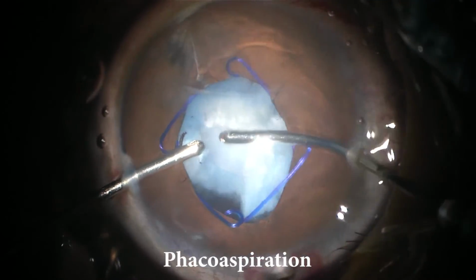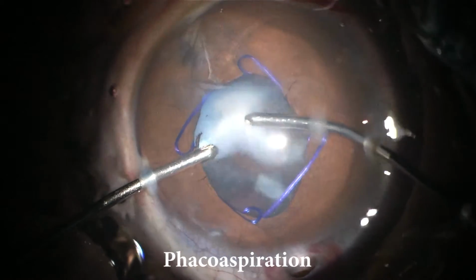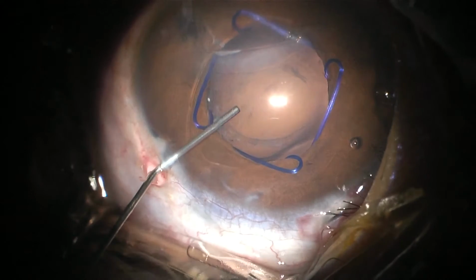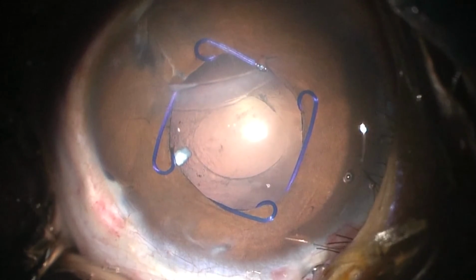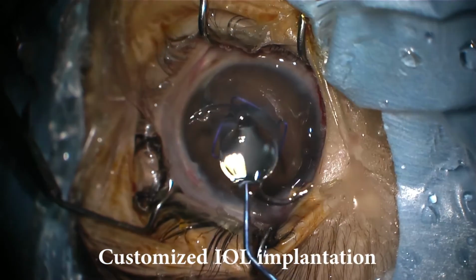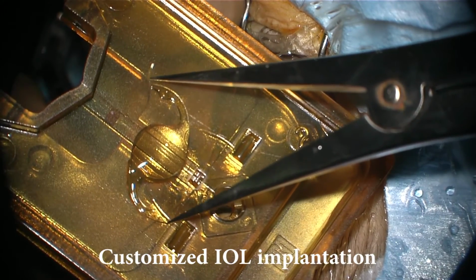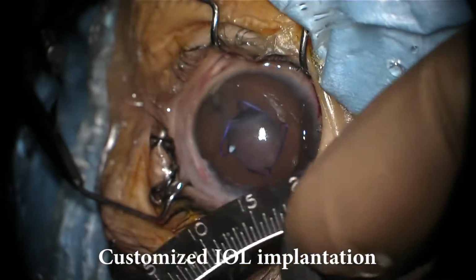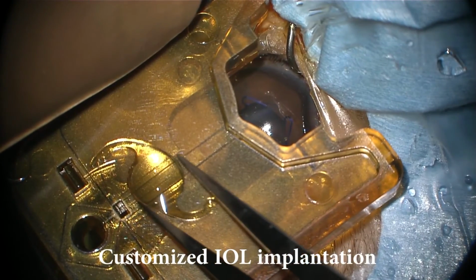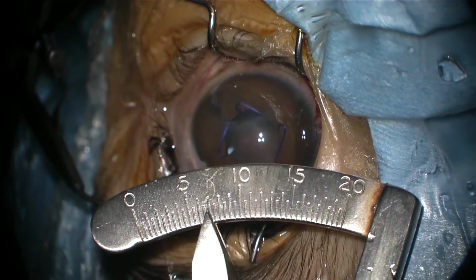The soft cataractous cortical material was then removed with the help of irrigation and aspiration, and the capsular bag was formed with cohesive viscoelastic. A specially designed hydrophobic acrylic giant intraocular lens was then prepared for implantation into the eye. As per the preoperative measurements, the IOL had a maximum length of 17.5 mm and an optic diameter of 7 mm, with eyelets for transcleral fixation in case of loss of capsular bag.